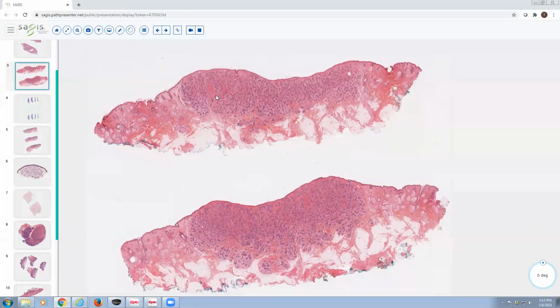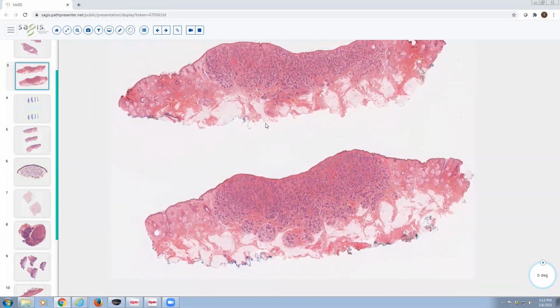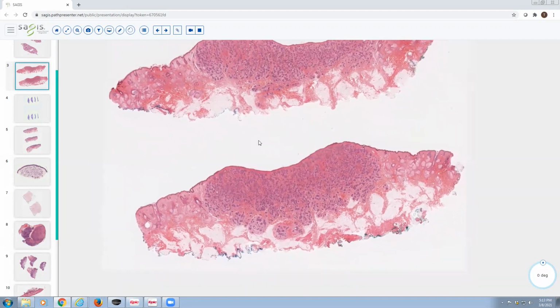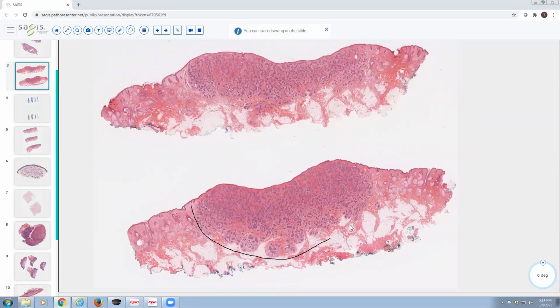Now, anytime we're looking at these neoplasms, you always want to start on scanning magnification and just get a sense for architecture. And it can be important not only to help you decide if you think this neoplasm is benign or malignant, but also to get a sense of whether, if you've decided it's in the tricho family, you are dealing with a trichoepithelioma or a trichoblastoma. So on scanning magnification here, I would describe this neoplasm as circumscribed. So easy to tell where the neoplasm starts and stops.